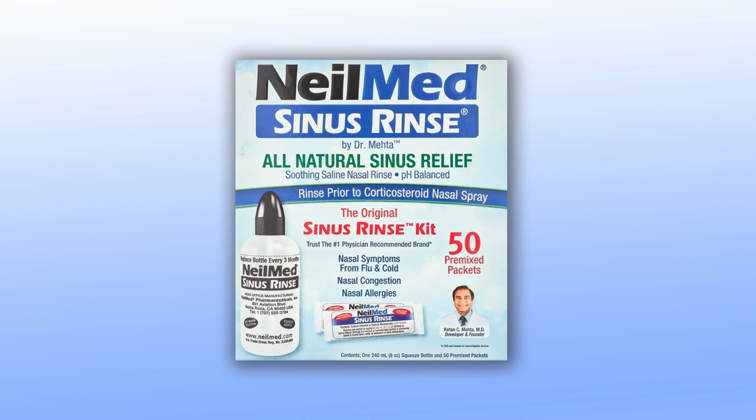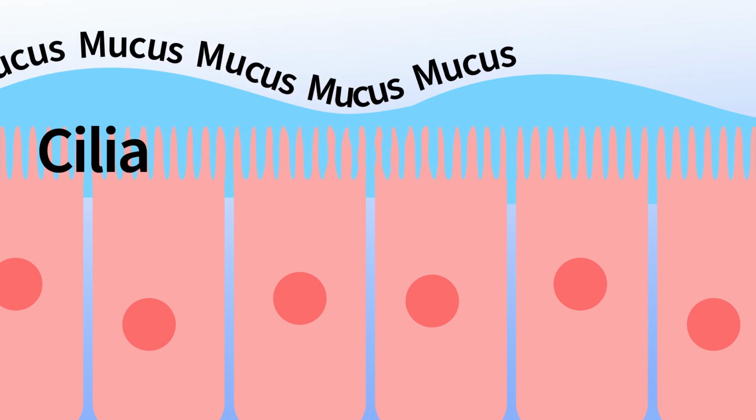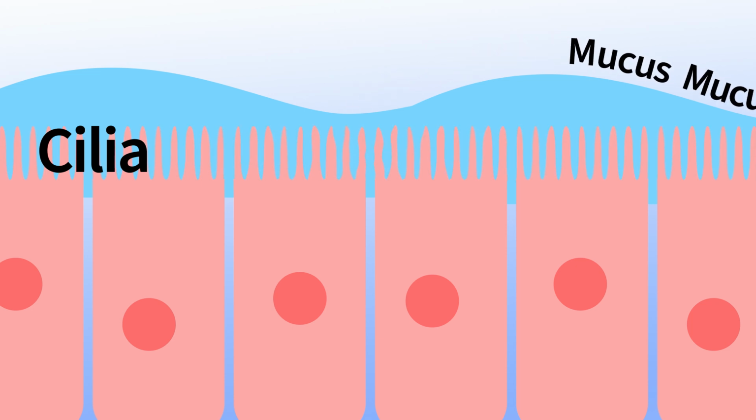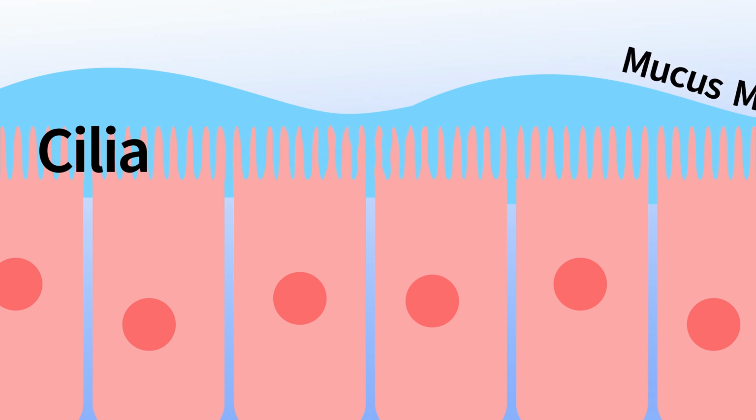So I see a lot of people who have chronic clearing of the throat or their ears feel full or plugged. So I'll have you do the neti pot, and I like you to do this one. And the reason why is because we have little cilia, which are hairs inside our nose. And the cilia move like this to move mucus that we produce. We produce 1.5 liters of mucus, snot, in our nose every day. So we have to take the cilia and move that mucus down our throat, and then we swallow it and we don't even notice it as long as your nose is functioning correctly.